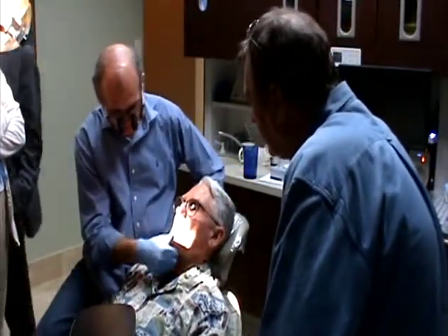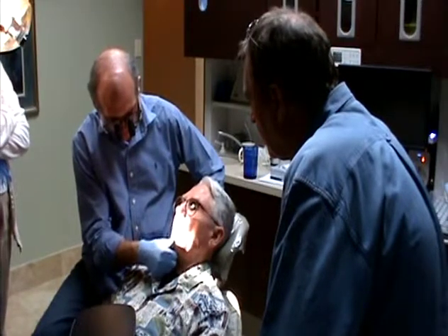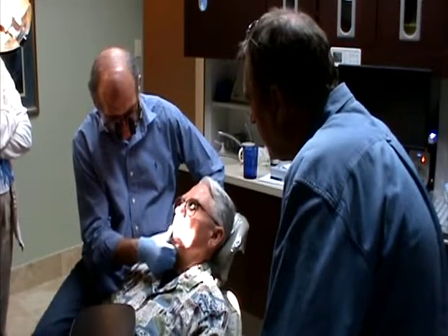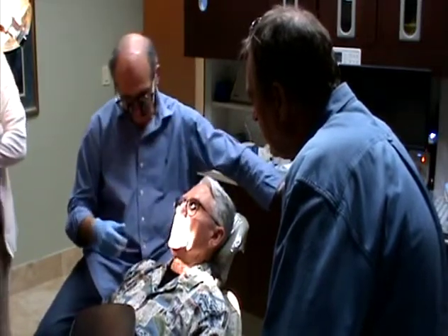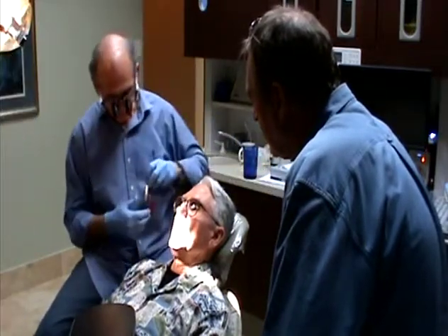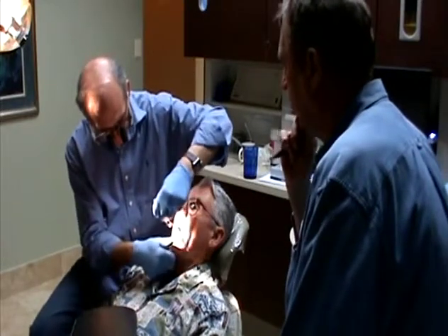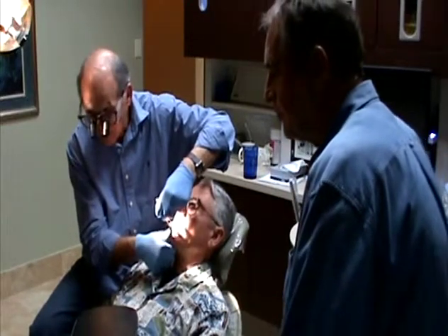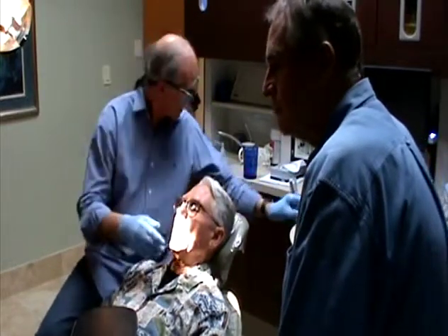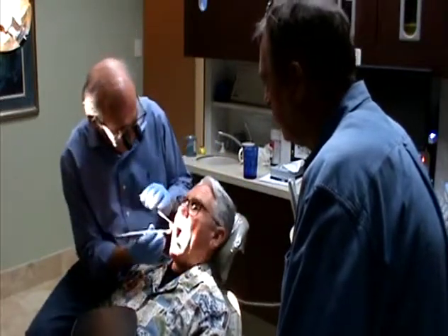Can you hear me? Open, please. Still hitting only on the right side. Now, when I bite, I can hit on the left side, but when you tap it real appropriately, yeah, it's only on the right side. This one is a little shorter. You sure? A little bit.